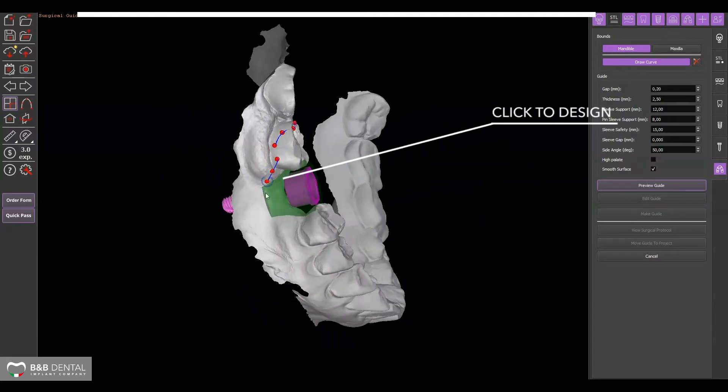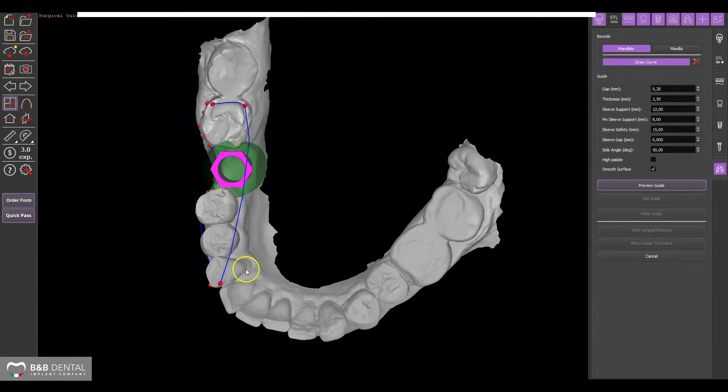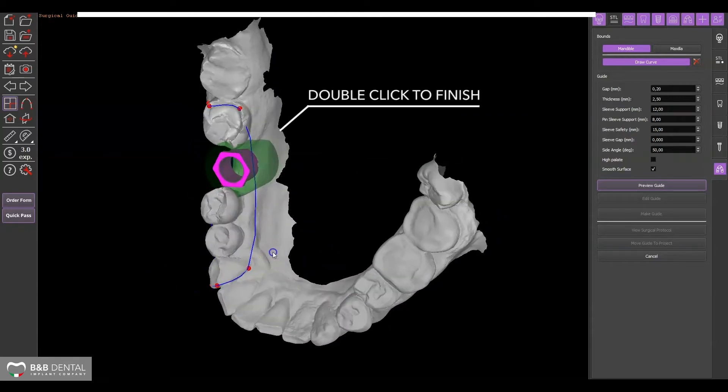Create a shape by clicking on the model until an area is defined. Complete the operation with a double click.